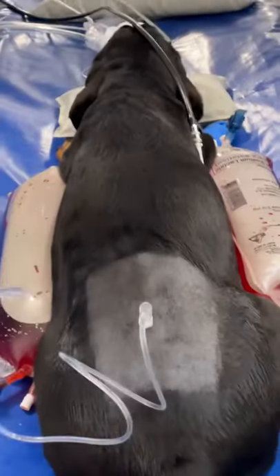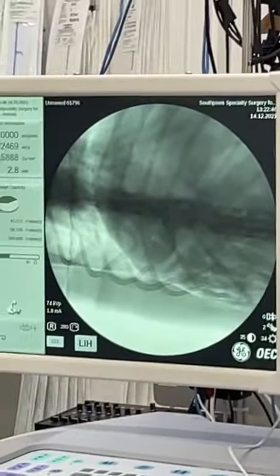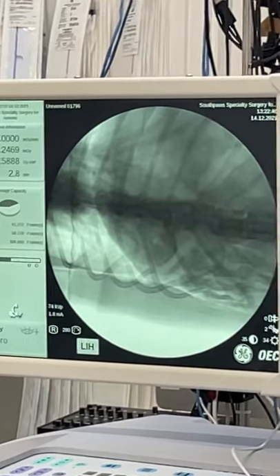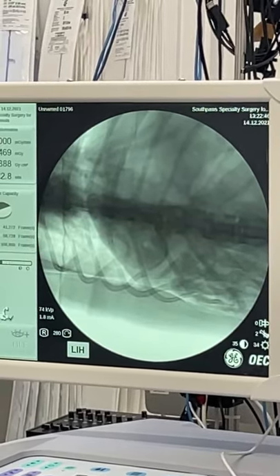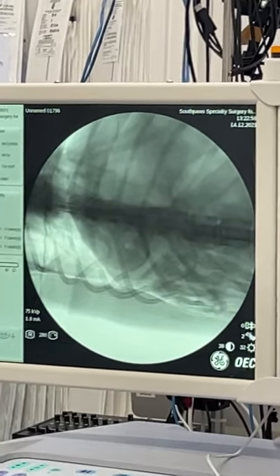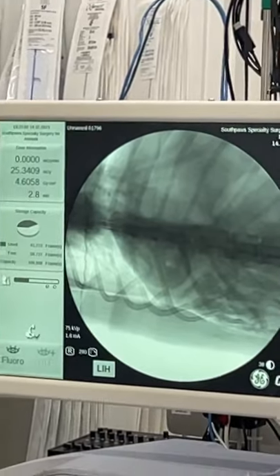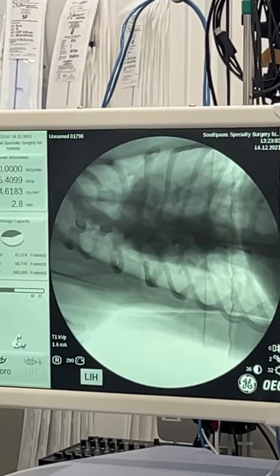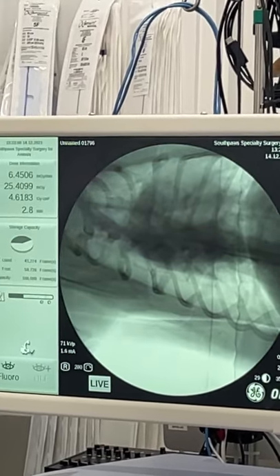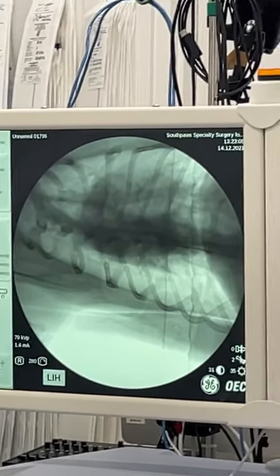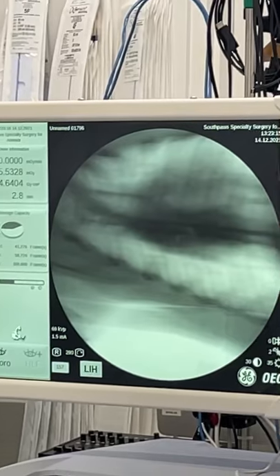We can see that we've lost some contrast there already. From about T11 up to L1/T13 we're missing contrast. That just confirms that we've got compression at the site that we thought we would on the CT scan. I'm just continuing to inject more. Often you'll have a little deficit in contrast in the middle of the cranial thorax and that's expected.